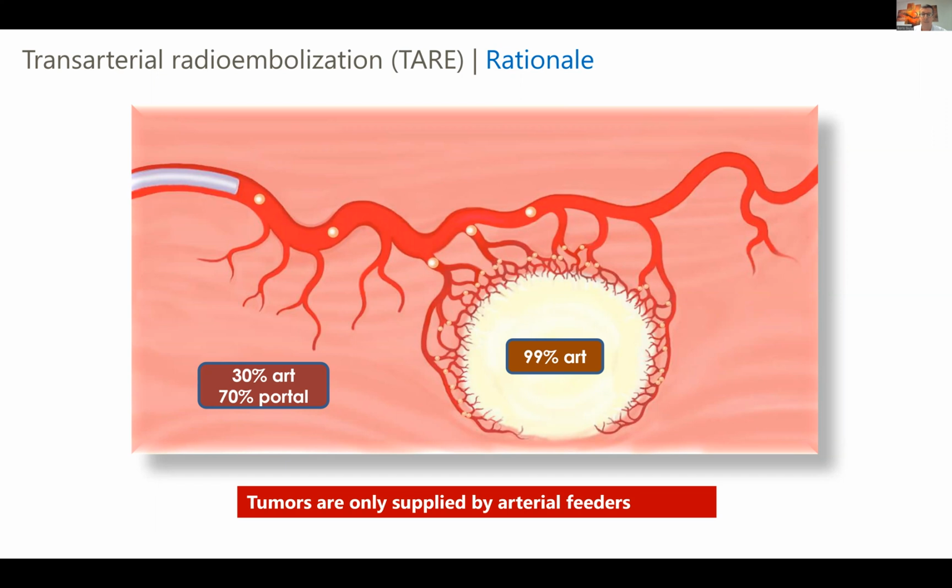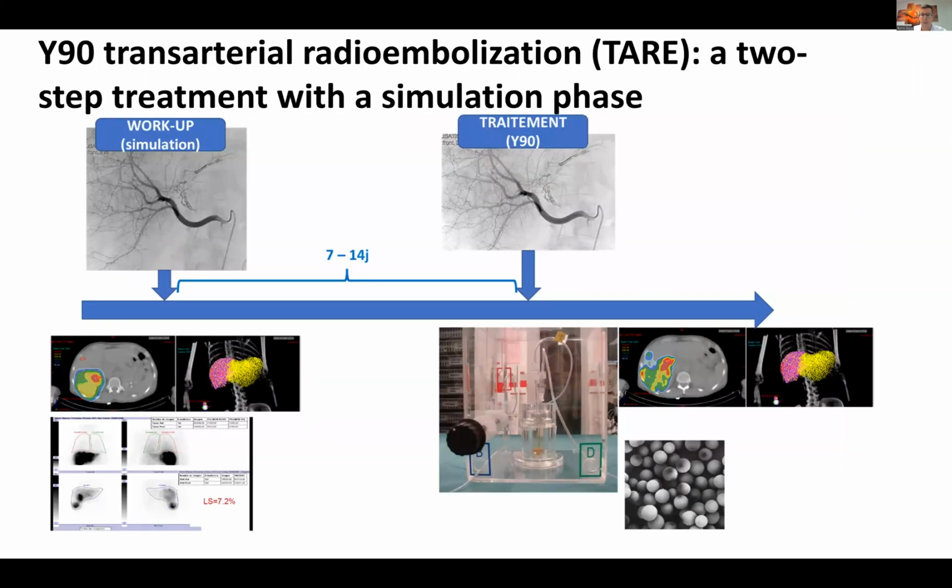That's the rationale. And for this treatment, and I think it's the most important point, we have a simulation phase. And that's probably the only treatment, maybe with also SBRT, where we have a simulation phase. And as you will see, it's a very important point for this technique.